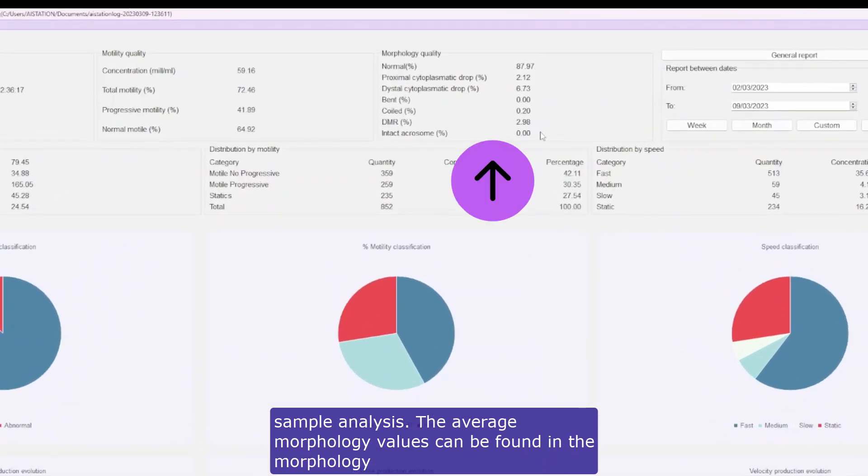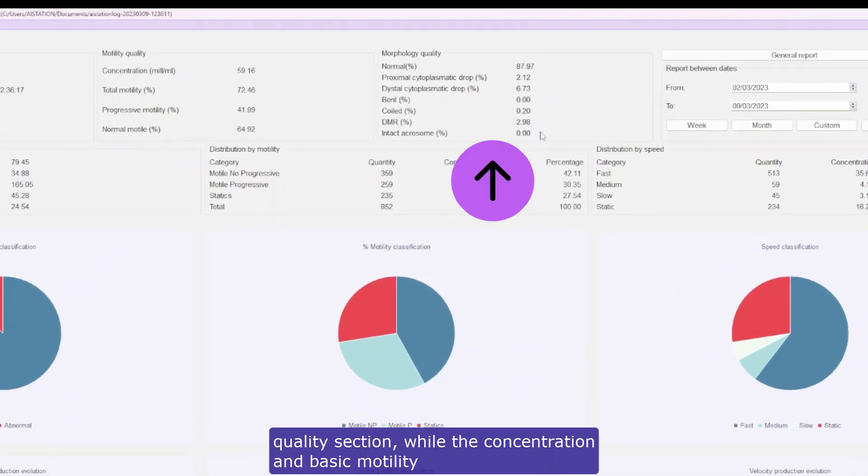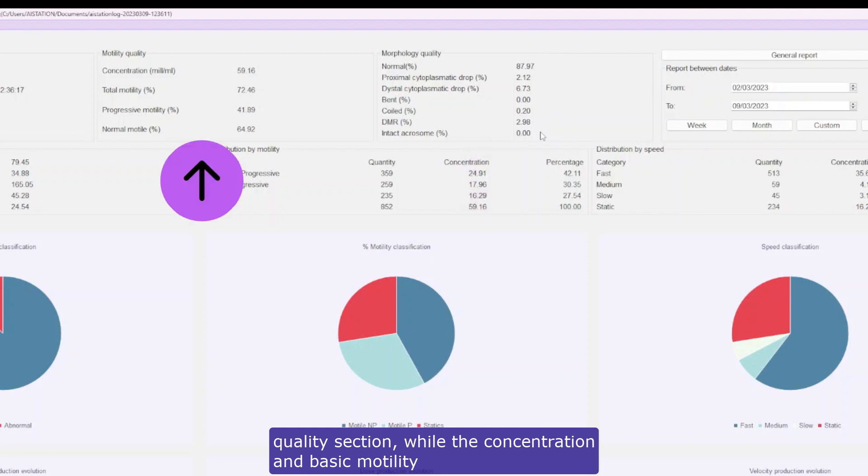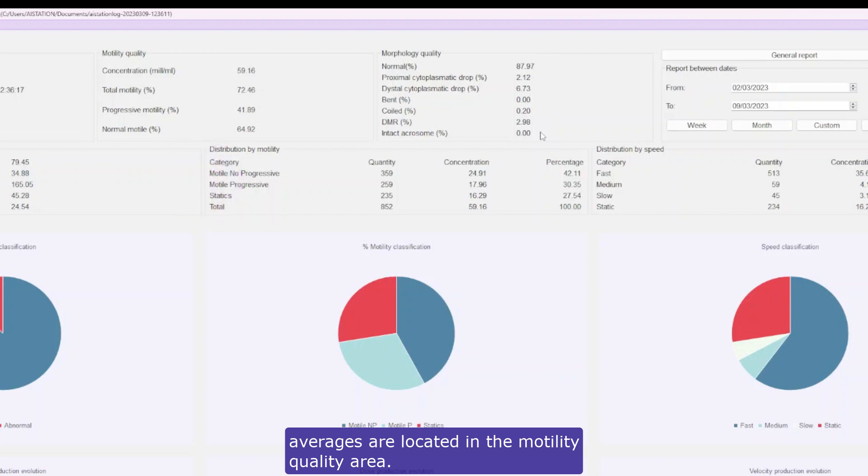The average morphology values can be found in the morphology quality section, while the concentration and basic motility averages are located in the motility quality area.